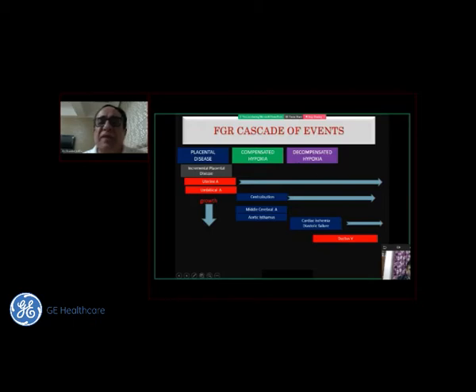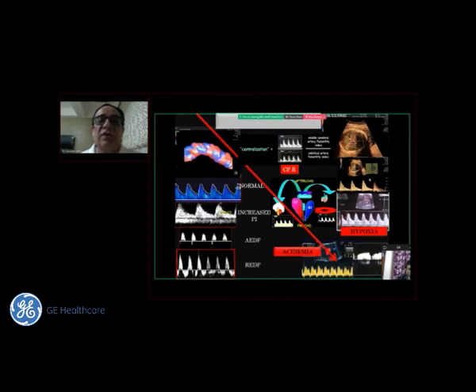Then we have a decompensated stage, because if you have worsening of the placental disease, the fetus can no longer compensate, and then you have cardiac ischemia and diastolic failure, and the ductus venosus starts showing us changes. And finally, there is serious injury and death, and only before the pre-terminal stage we start seeing CTG changes, and therefore the ductus venosus is really an important marker. Of course, if you have CTG along with it, it is also a good combination. So this is the centralization phenomenon. As the umbilical artery resistance increases, the cerebral circulation diastolic flow increases.